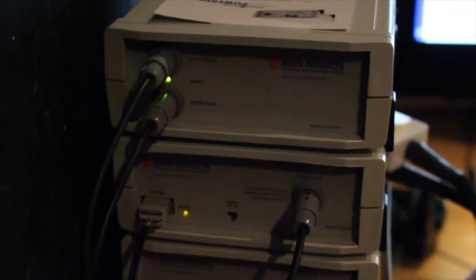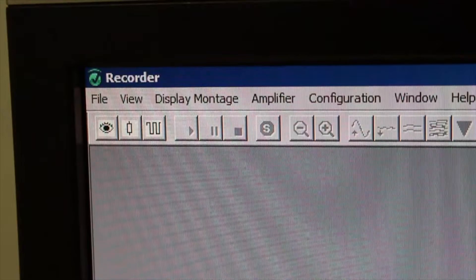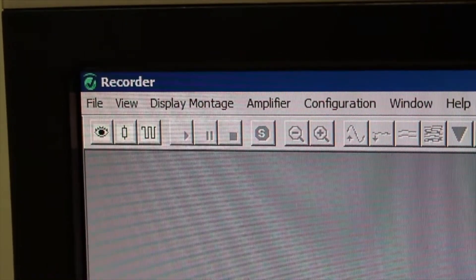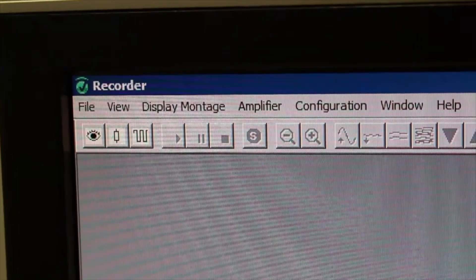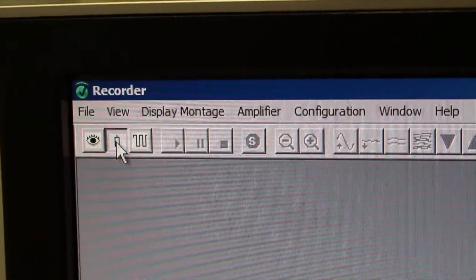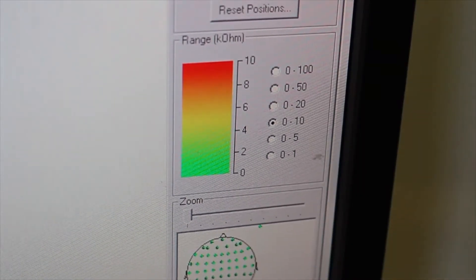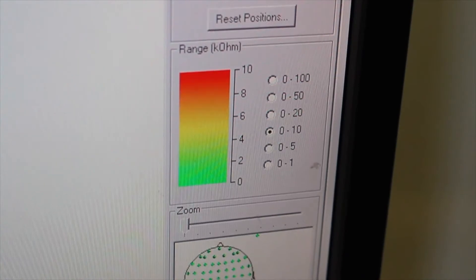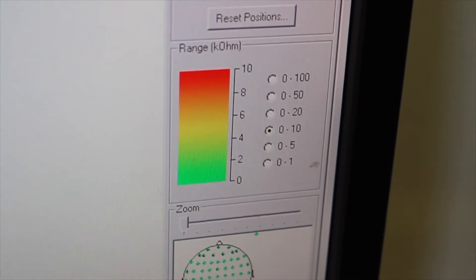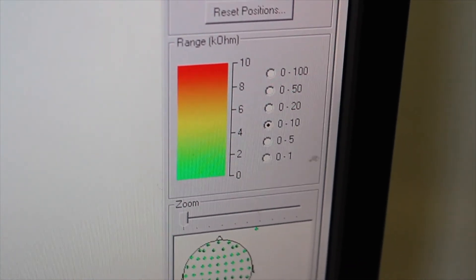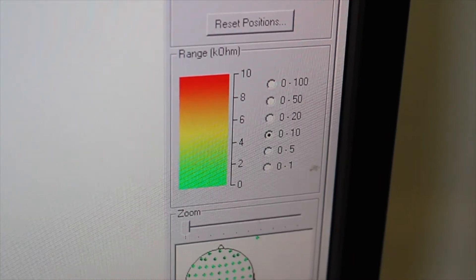Once connected, switch the amplifiers on and check that power is being supplied. Now you need to check the quality of the signal the EEG cap is receiving. Open BrainVision on the EEG PC and select the middle icon to view the impedance measures. Adjust the scale on the right to spot electrodes with high impedances. All electrodes should be under 50 kilo ohms in order to record EEG data correctly.